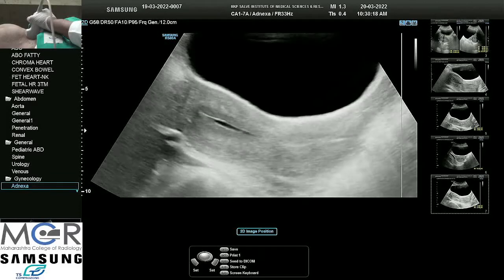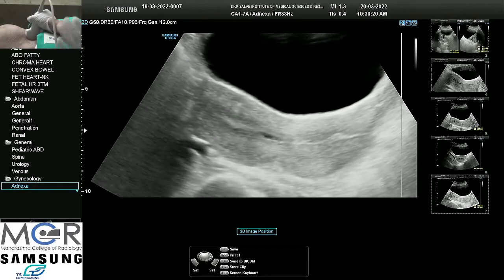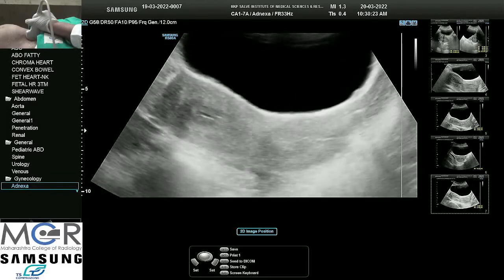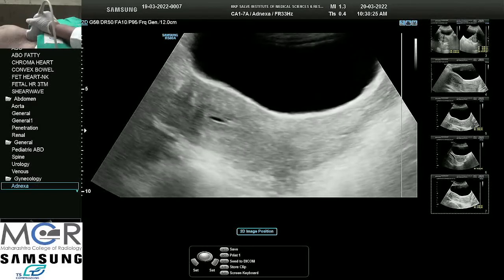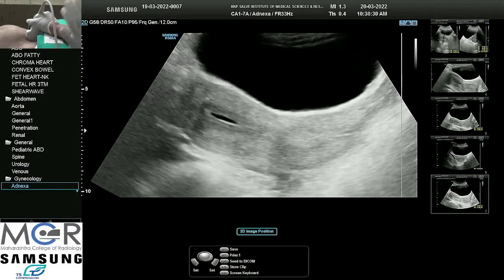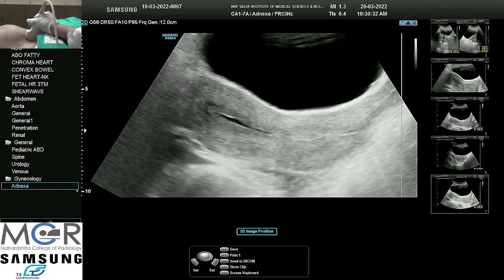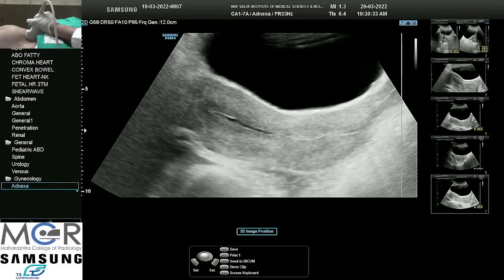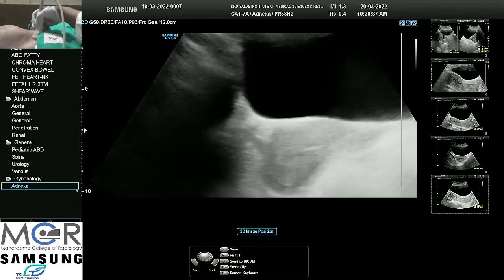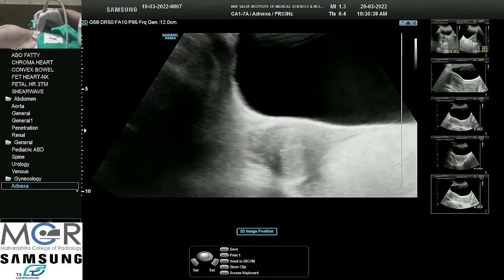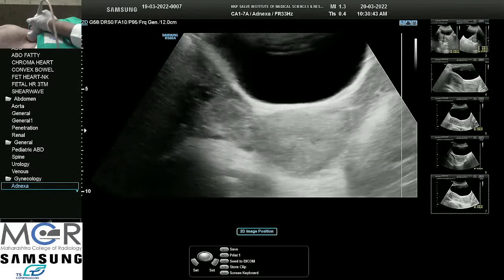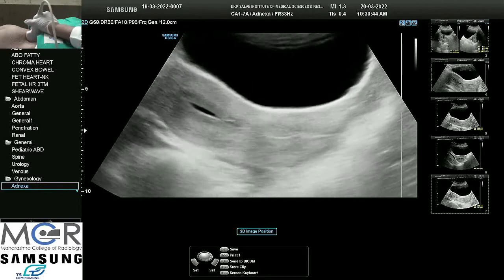Ideally, we should not separate the examination of pelvis from abdomen. We should also be seeing the kidneys, because the urogenital system develops together. So if there had been any congenital abnormality of the uterus, we would have wanted to see the kidneys as well. But here everything seems normal, so now we would stop the abdominal examination and proceed to transvaginal.